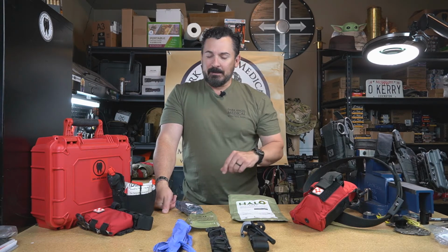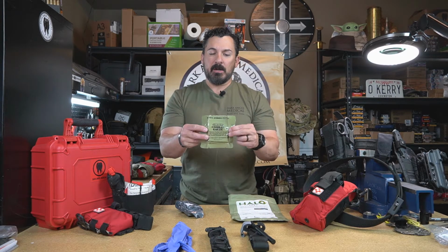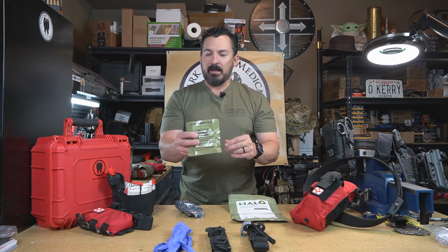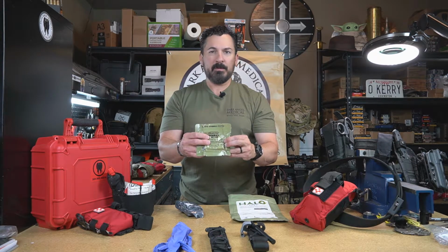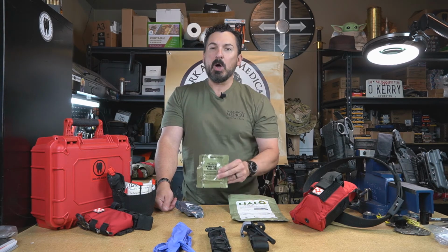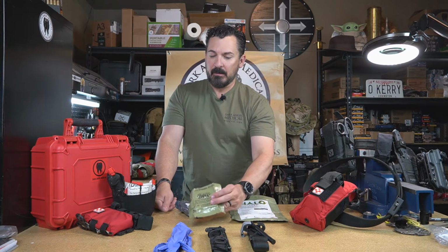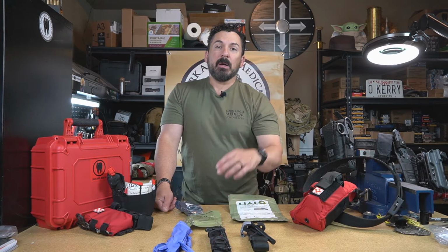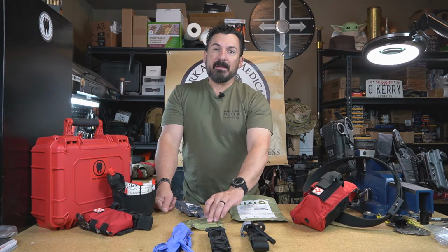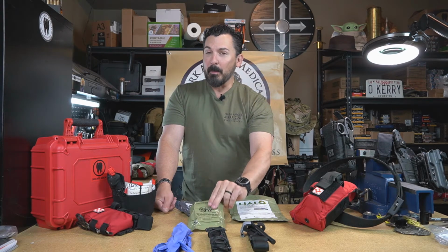All right, next thing, we're talking about stopping that bleed. Some sort of hemostatic gauze. This is the QuikClot Combat Gauze from Z-Medica. And this is battle-proven, combat-proven, austere environment-proven, worst-case scenarios, this gauze works. It stops bleeds very quickly, major life-threatening bleeds, and it packs into those areas where you can't get a tourniquet. Okay, so it's not amenable to tourniquet use. Think about this. That's 12 feet of gauze, y'all. That's 12 feet of gauze. That's a lot of gauze in a small package.